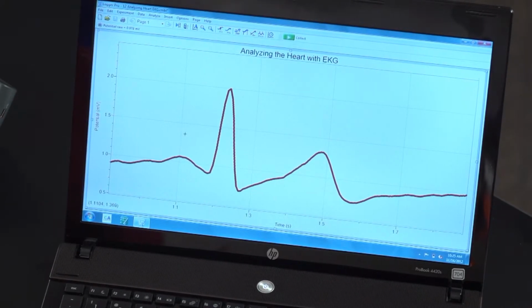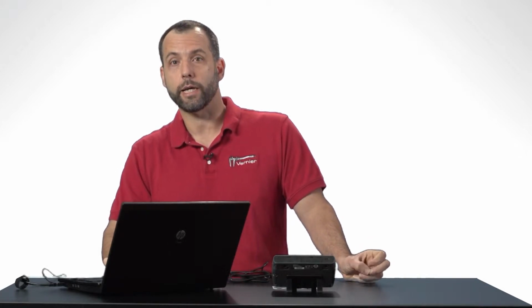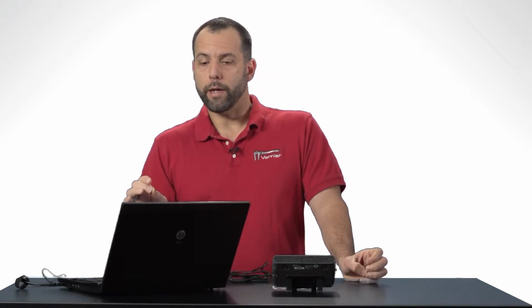And these are the key important things that most people are interested in when they're recording or looking at an EKG trace. They want to see the P wave, the QRS complex, and a good T wave. Now there's an even better way to look at an EKG trace. And this is what I would recommend if you're teaching STEM or you're teaching at college.